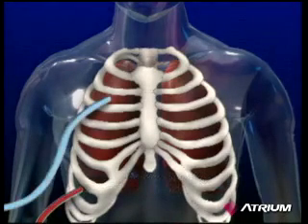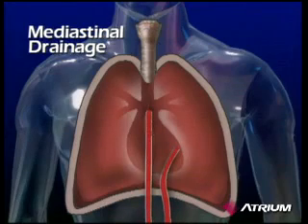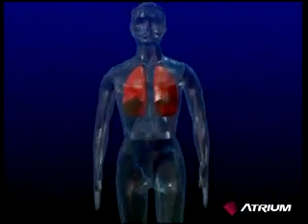The need for chest drainage is also required following open heart surgery or chest trauma to evacuate any pooling blood, which, if left in the mediastinal cavity, can cause cardiac distress or tamponade. As you can see, chest drainage is indeed a life-saving procedure and one of the most important services a physician and nurse clinician can render.